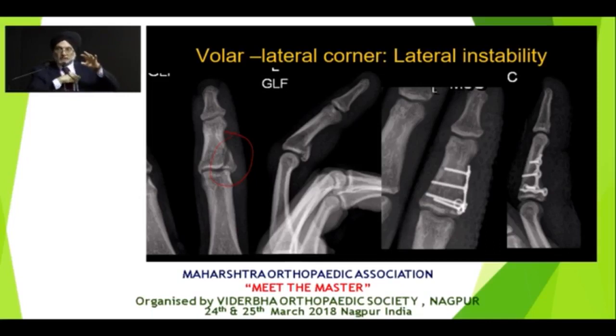And the next 3 weeks, your therapist will make them the Wendell Merritt splint, which they will make for you after they read the paper. And the splint is something like this. It's like my pen. So the patient wears it in their hand, and they go to work. They're working, typing. And because that finger is always held down, that central slip is detensioned. See? So you can use your hand and do everything with the splint in your hand like that. So the patients get this splint at week number 3.